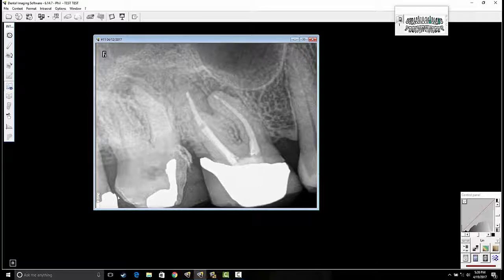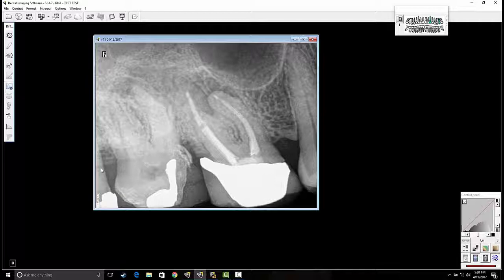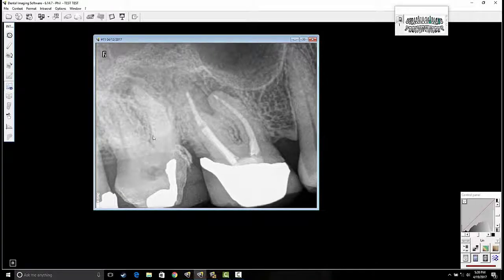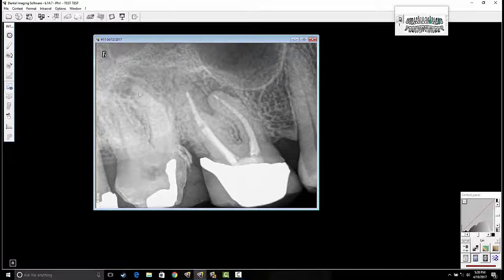In addition, there was a 10-millimeter pocket on the mesial buccal of tooth number one. I elected to get a cone beam scan because I was seeing some evidence of apical periodontitis on tooth number two and on tooth number three.